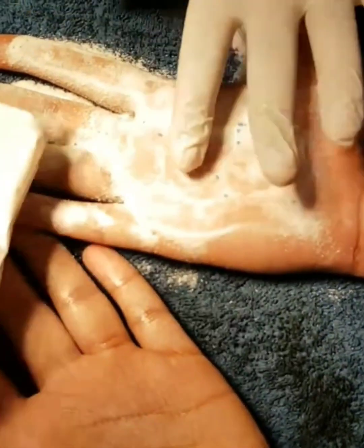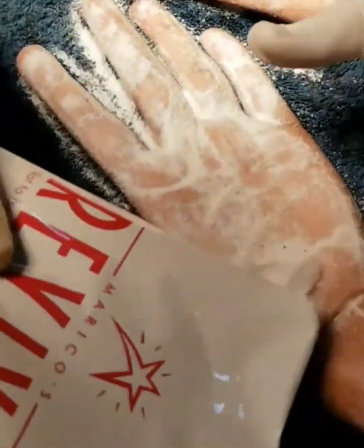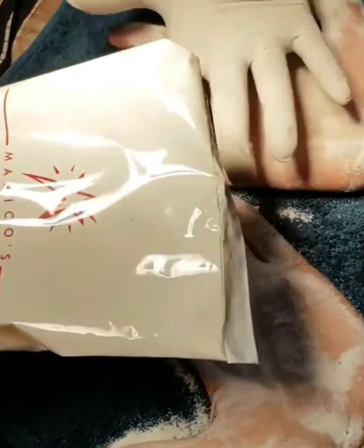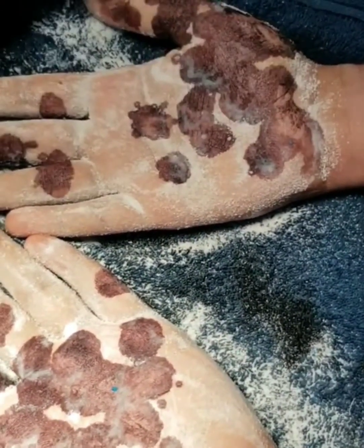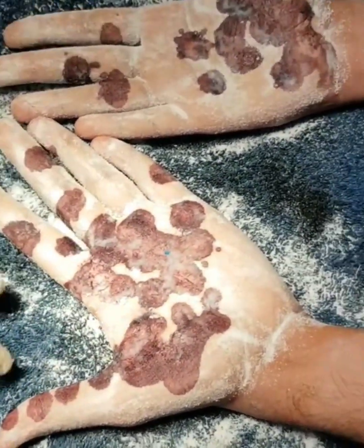Thereafter, starch powder is gently sprinkled onto the entire surface of the palms. Wait for the sweating to set in, which will take about 5 to 10 minutes depending upon the degree of hyperhidrosis. After about 10 minutes, this is what we see — take a picture to remember which areas have the highest sweating.